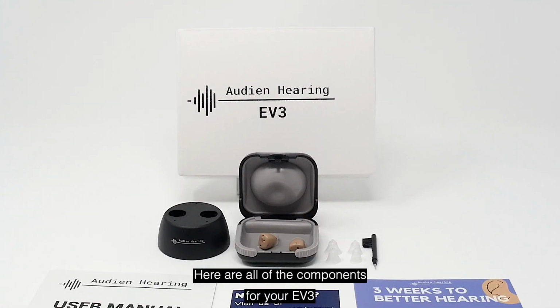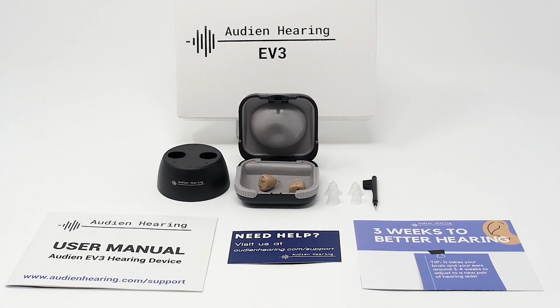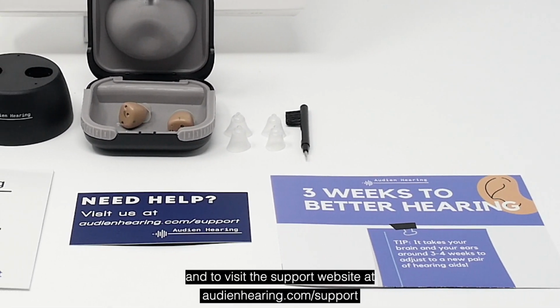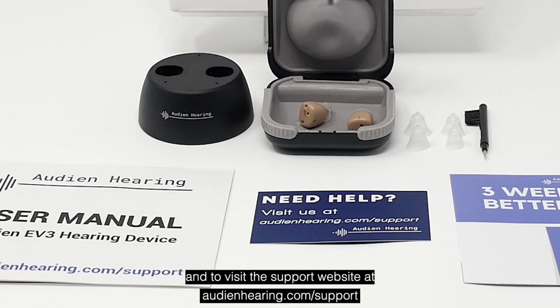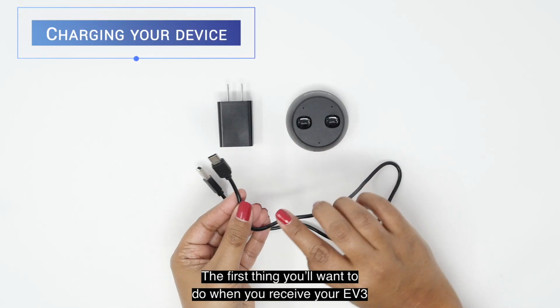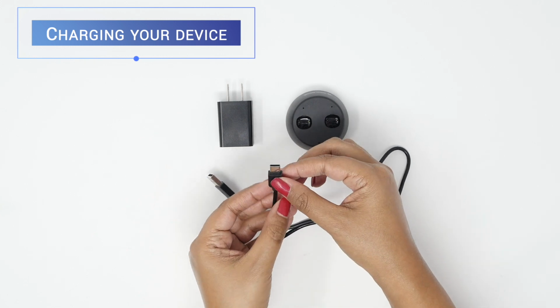Here are all of the components for your EV3. Please be sure to carefully review all of the inserts and to visit the support website at audienhearing.com/support. The first thing you'll want to do when you receive your EV3 is to charge it.